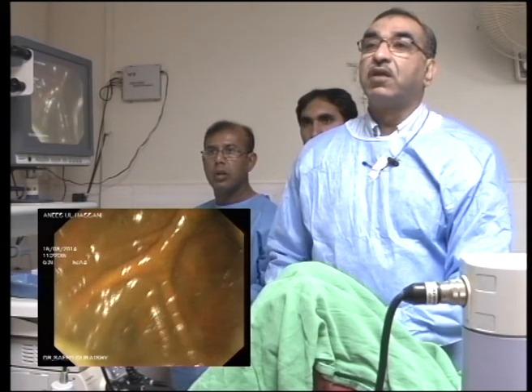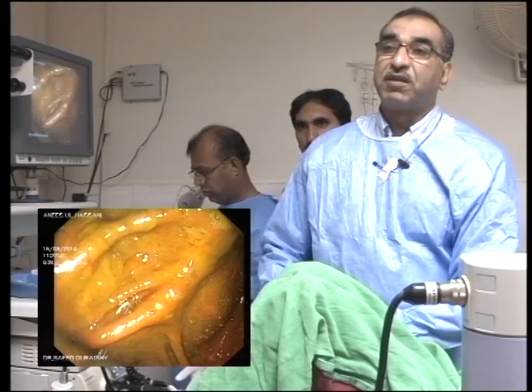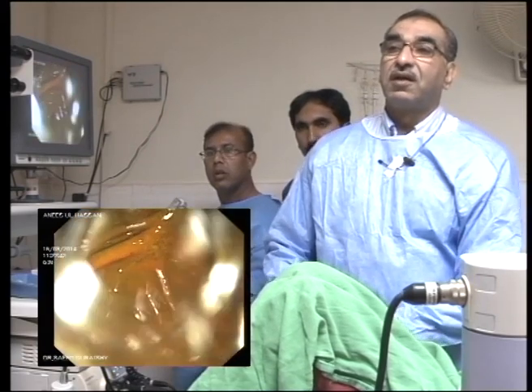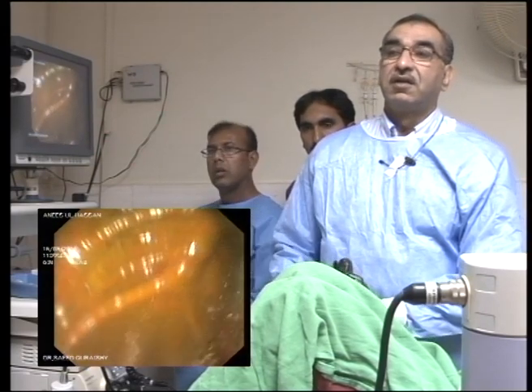The problem is, you can use the biopsy forceps as a guide wire, but it makes it a bit uncomfortable for the patient because it will cause pain. It's not really indicated, so we can leave it and you can do it in the next patient if you want. Okay, it's up to you.